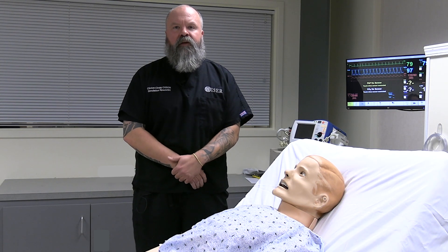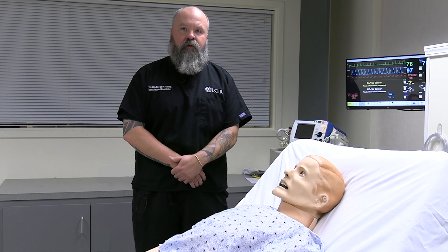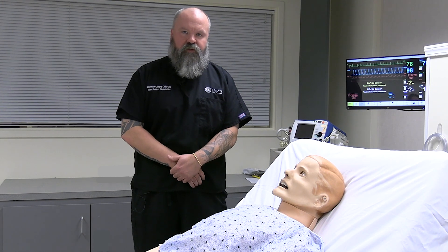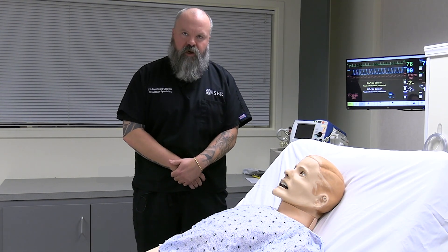Hello and welcome to Wiser. My name is Clinton. I'm a simulation specialist here. Today we're going to learn about SimMan 3G. SimMan 3G is a high-fidelity simulator made by Laerdal. Today we'll go over all his features and applications to orient you to the mannequin for when you come here to learn at Wiser.